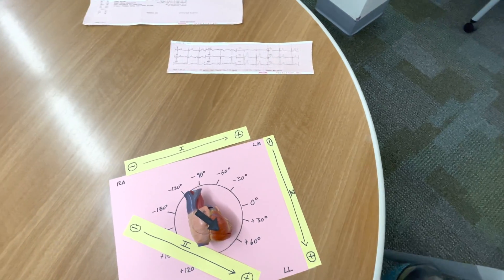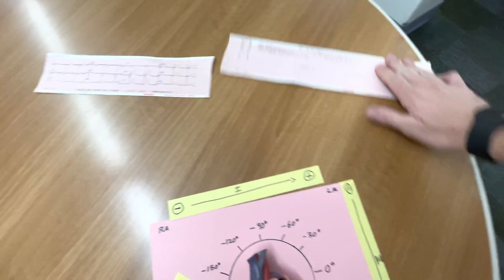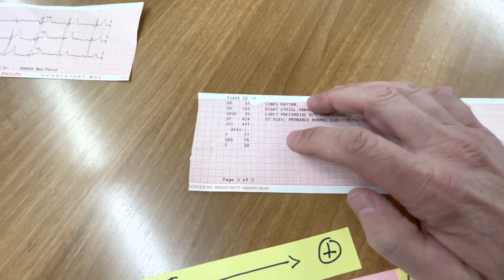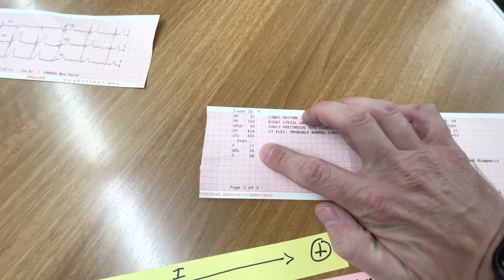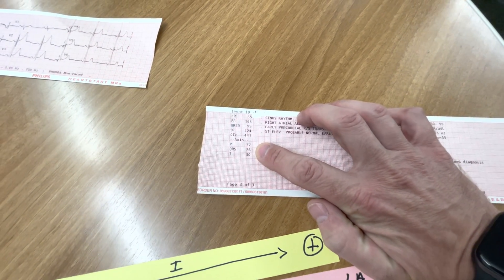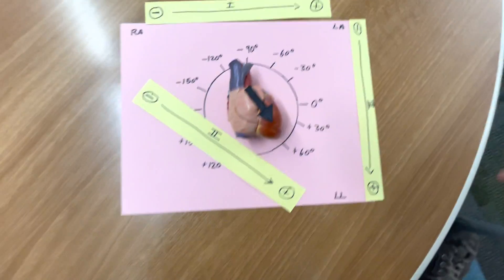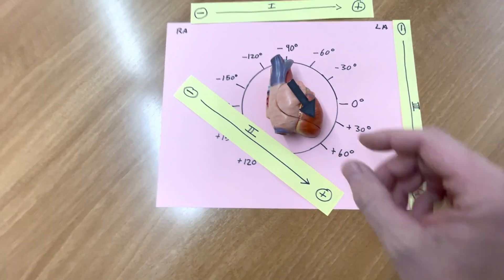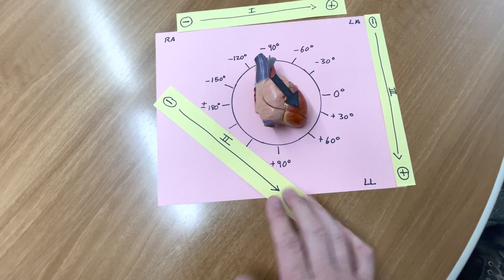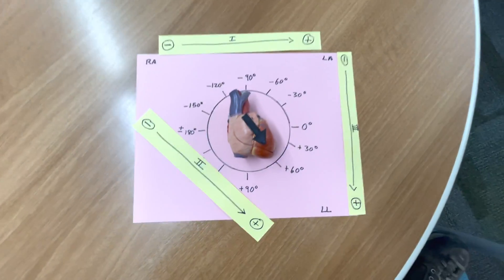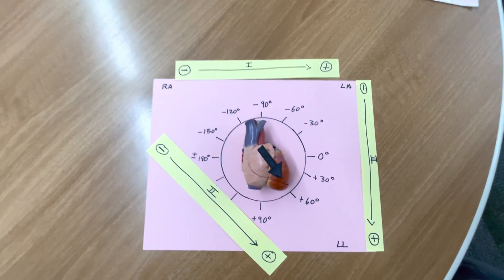Now, when it comes to axis deviation, the quickest way to determine that is just to go to your monitor, look at the QRS axis, and whatever that is in degrees tells you the actual axis. In this case, it's 75 degrees, which would mean that the axis would be right down here with me. So, let's talk about what normal axis is.